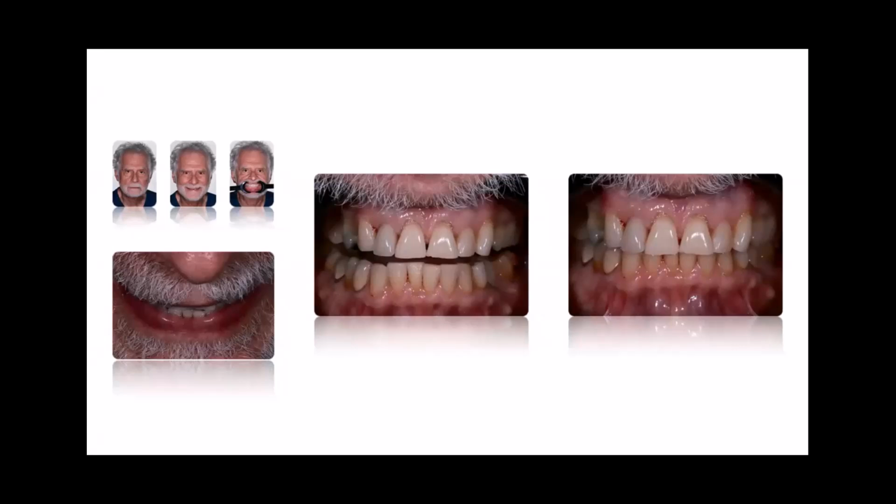Why is it so important? Landmarks. I can utilize all the landmarks in the face to superimpose both faces together in my system, and then can start designing the denture. That's so important, right? And then what you see here, we just go in a close-up, we zoom in, right? They crop out the face if we need a really close look to it. As a kind of bonus picture, the 12 o'clock shot where you see the left lower side is really good because it shows a little bit more the buccal, the facial corridor and the curve of the arch, which is nice to have. Not necessarily we have to have it if we have all other scans necessary.